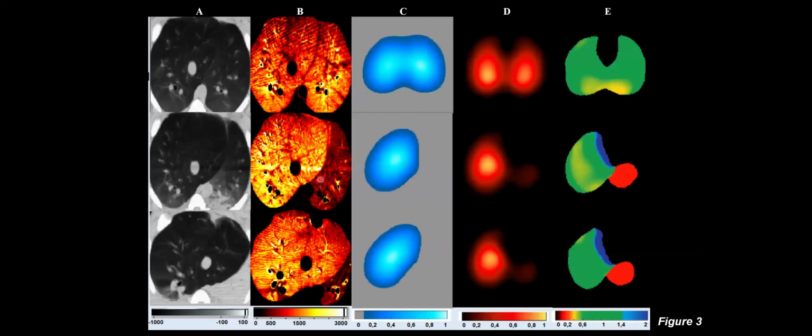And we did these occlusions of the bronchial tree using multiple FiO2. This is a low FiO2, so you have low perfusion, complete blockage of the ventilation in the left lung, and the EIT detected only shunt problems.